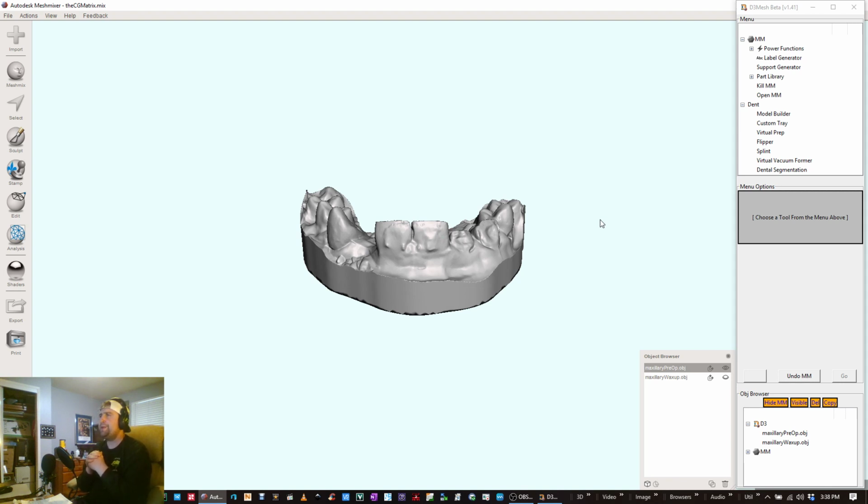So in this video, like I said, it's a full rehab kind of case. It's not necessarily decay per se. It's more of a reduced dentition, I think, if I'm remembering correctly, with wear and attrition, that type of thing. So he took initial impressions and did a full wax up, I think by hand. I'm not quite sure on that one. This was quite a while ago, so maybe it was by hand. Could have been virtually.